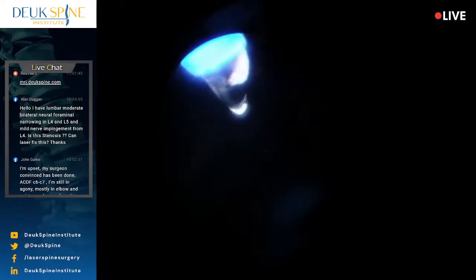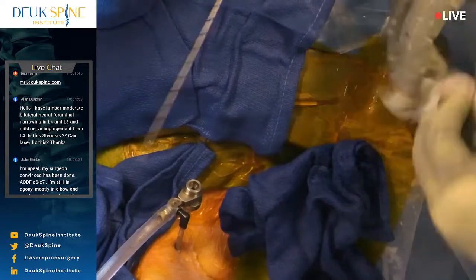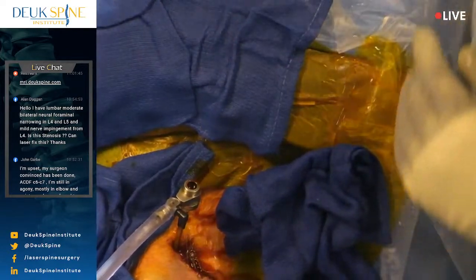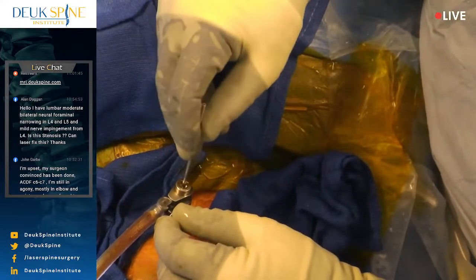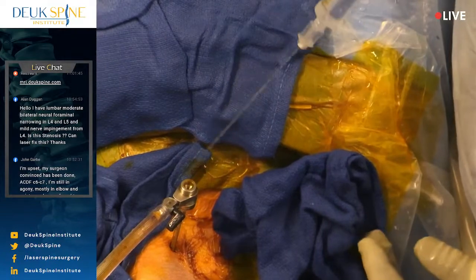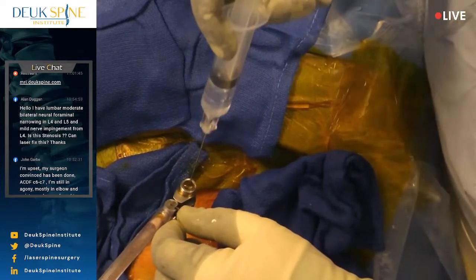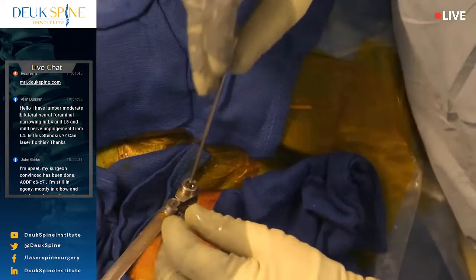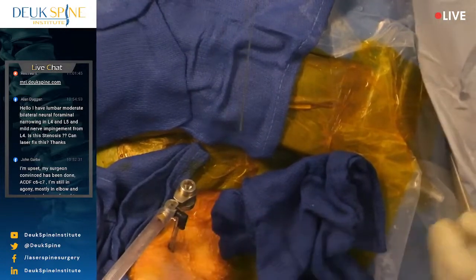Scope off, please. Now, why aren't we fusing this patient? I'll tell you why. Because we did not take the disc out. We left 95% of the disc in there. We only took out maybe 5%, which was the herniations. We didn't take any of the normal disc out. So we left the normal disc there. We don't need to put a cage there. We don't need to put an artificial disc there. The only reason why people put artificial discs and cages and plates is because they had to take the disc out to get down here. But we did it in a stealthy ninja-like fashion. Because of that, we left the normal disc, and we don't need to do anything to stabilize the segment.